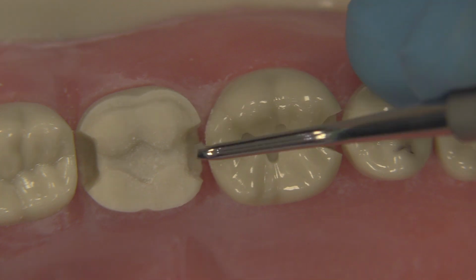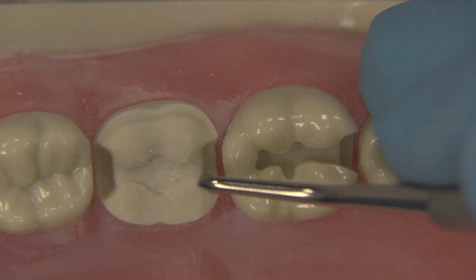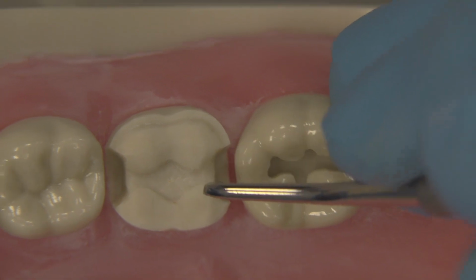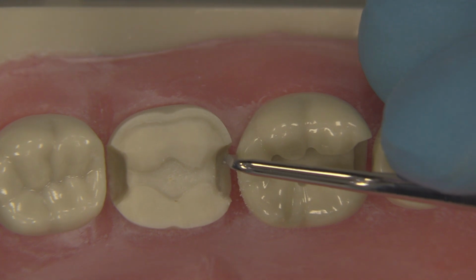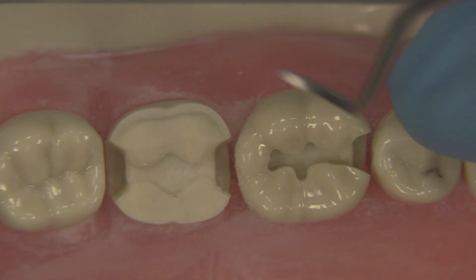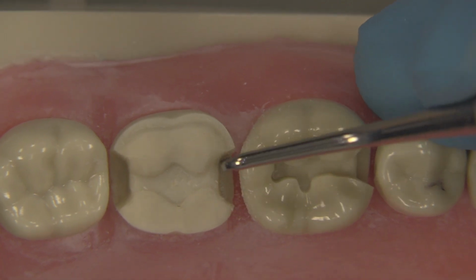Okay, so you can just take this to remove any loose rough areas. Like I said, you're not really trying to create a bevel. And if you tip it back this way, you won't create a bevel. You know what I mean? You're not holding it upright. You're holding it back, so the entire end of the instrument is touching the wall rather than just the edge of the tip. And what that's going to do is remove the rough areas at the end.